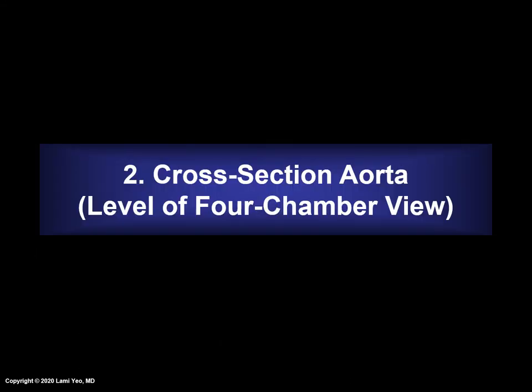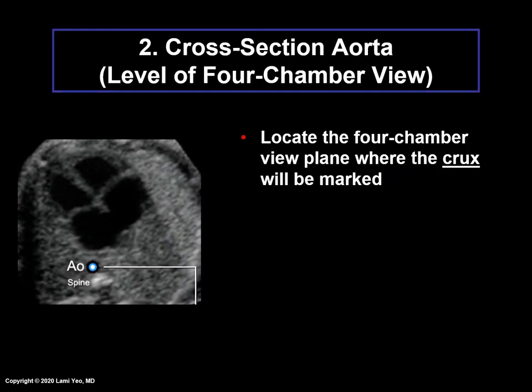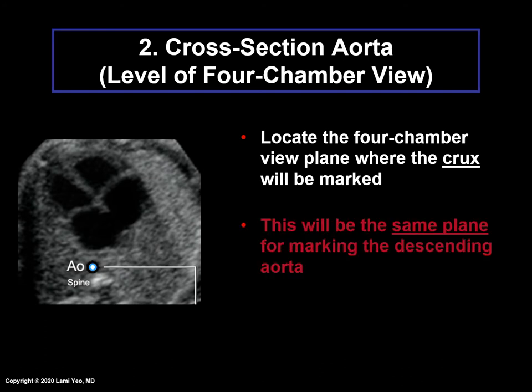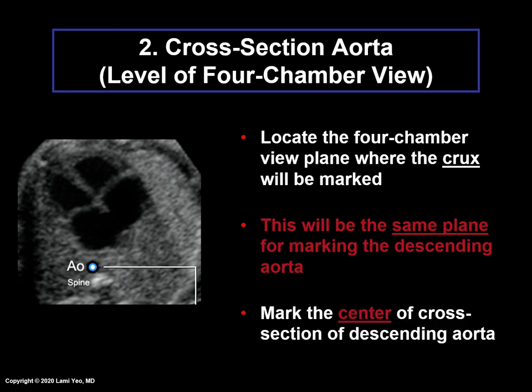To mark the second structure — the aorta at the level of the four-chamber view — one must locate the four-chamber view plane where the crux will be marked, because this will be the same plane for marking the descending aorta. Once you identify this four-chamber view plane, mark the center of the cross-section of the descending aorta as shown in the image.